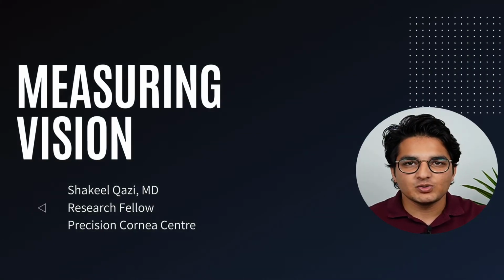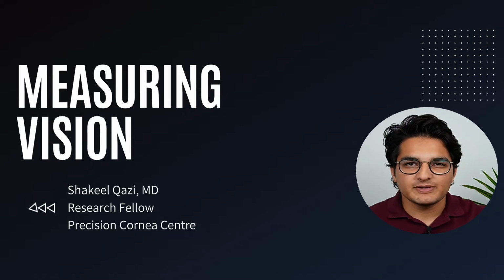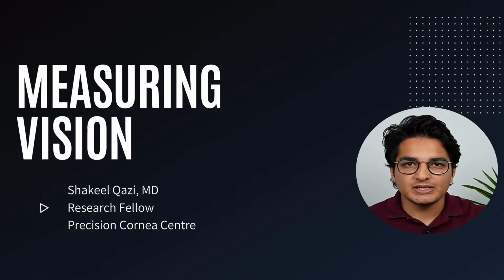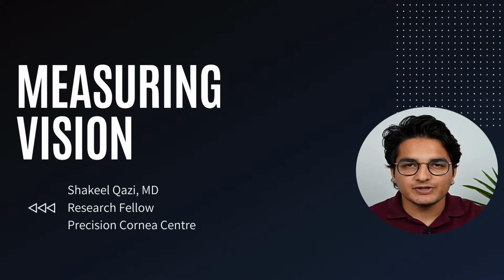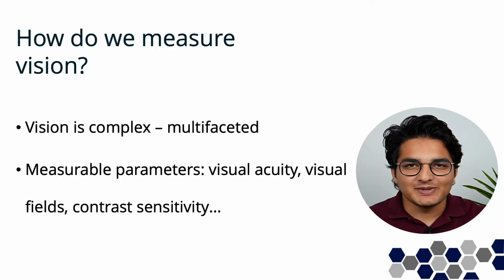In this video, we'll talk about vision. We'll go over some of the basics of visual acuity, we'll talk about the driving requirements, and we'll demonstrate how to measure vision. So how do we measure vision?